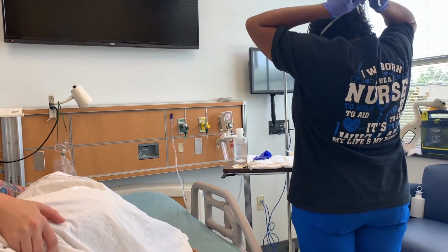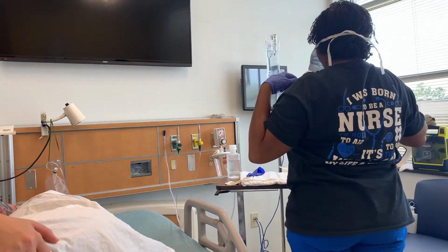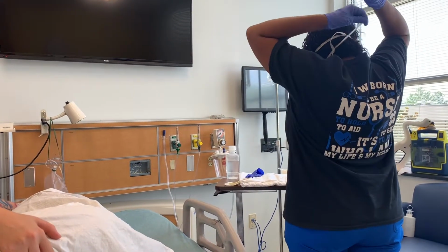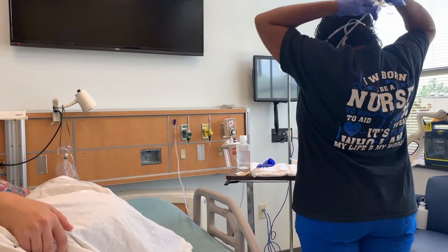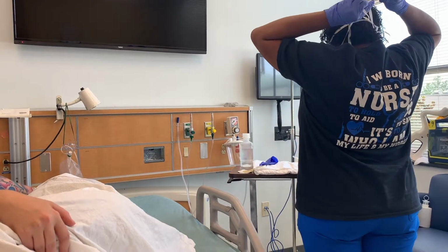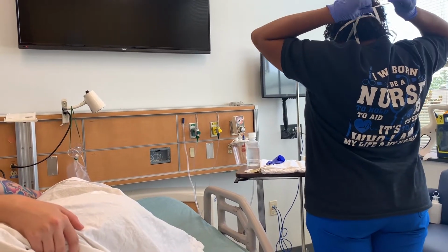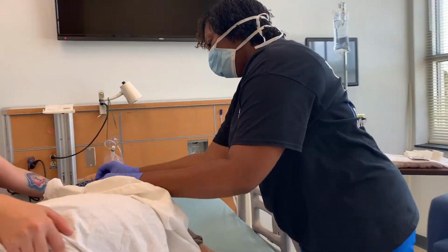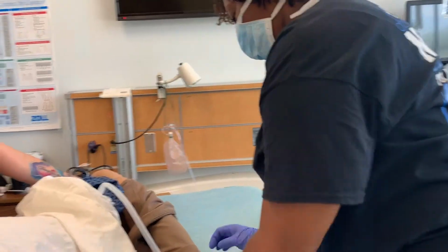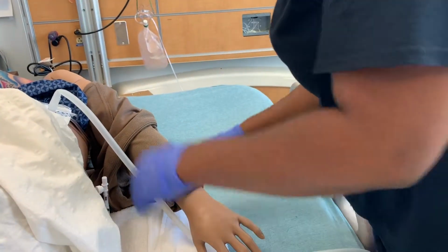Don your mask and other PPE according to facility policy. Next, expose the site and then place a Chucks pad underneath the patient to protect the bed.